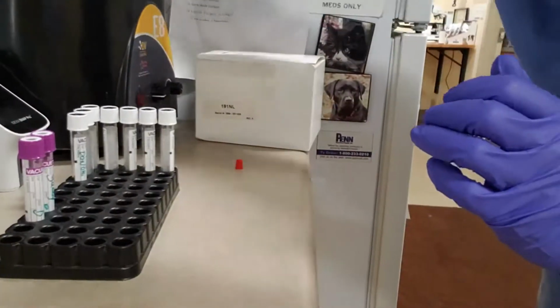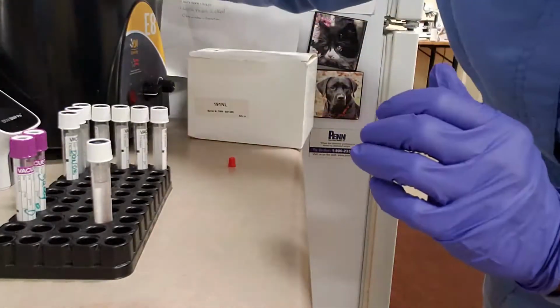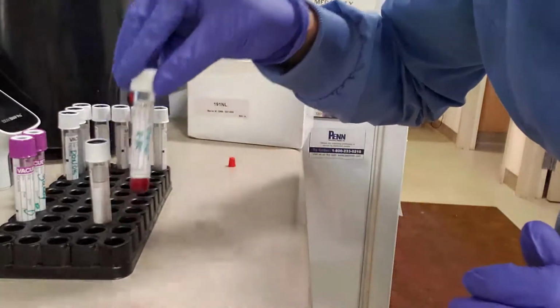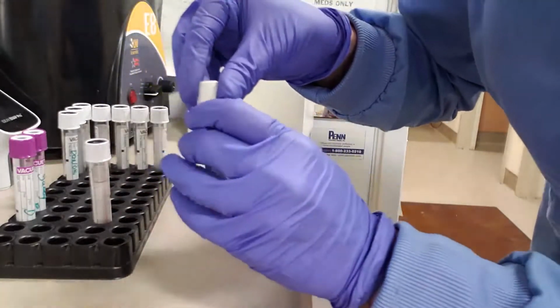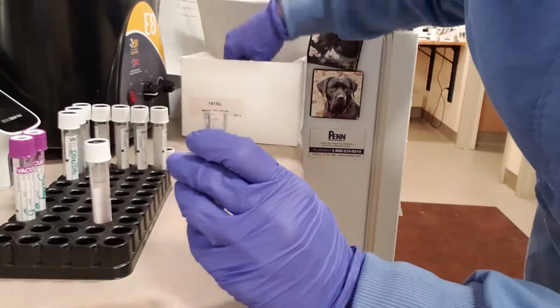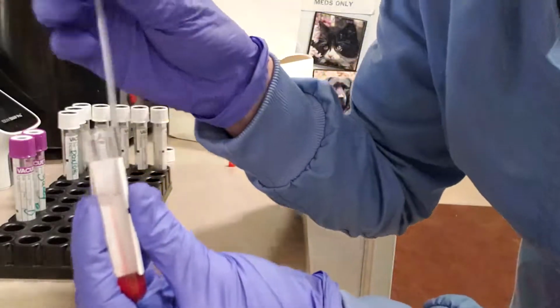Okay, so our final spin is done. So we're ready to take off our dirty saline and then create our resuspension. So do our donor red blood cell. Remove our dirty saline.